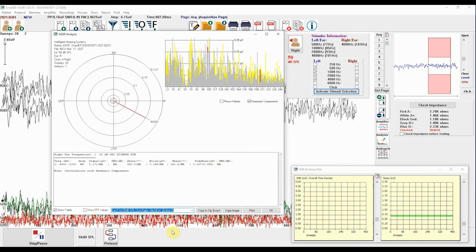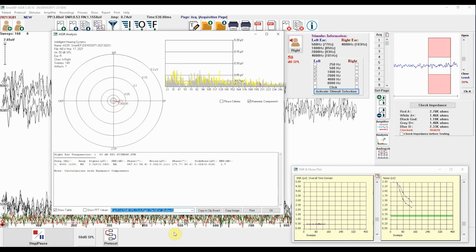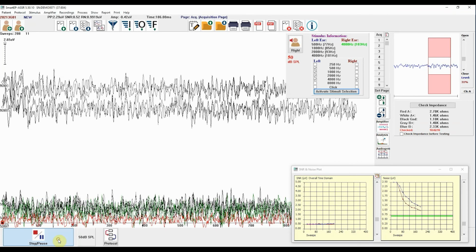Some patients may demonstrate difficulty processing a multi-frequency, multi-ear testing paradigm, even at super thresholds. Removing frequencies of stimulation as you decrease in intensities will result in higher thresholds at those frequencies on the audiogram.